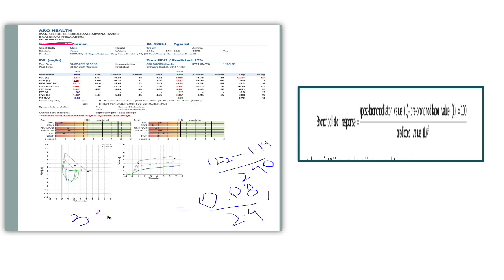So this is how we can calculate, and it has changed much from the previous reports that we used to have. It also gives us detail of the Z-score, where the patient is deviating, so a good graphical display and a visual display as well.